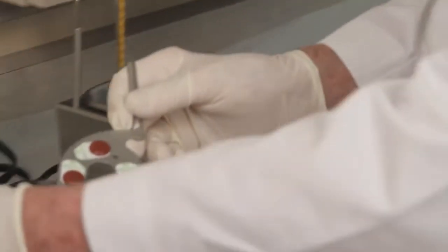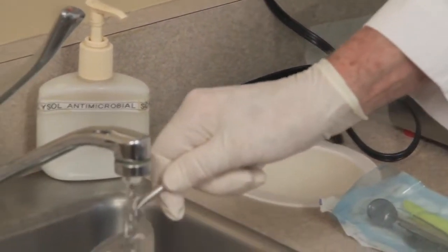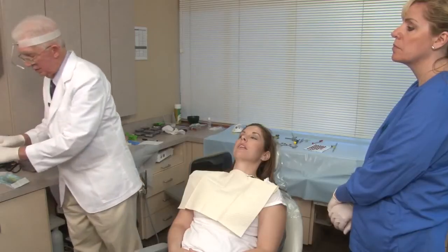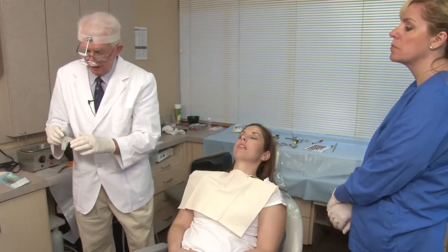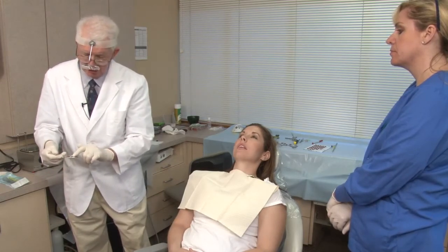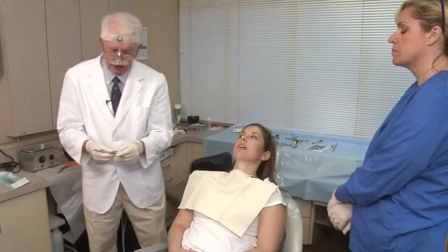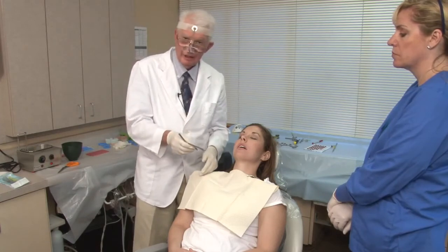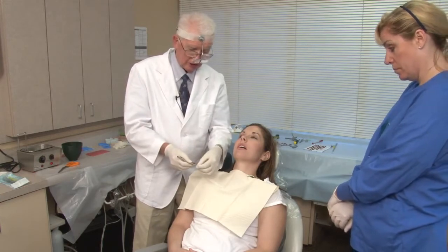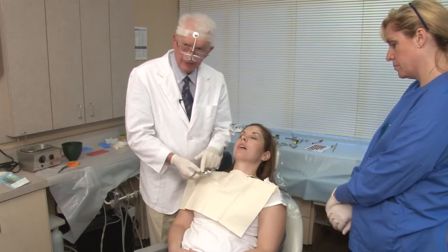So I will come over to the sink, turn on the cold water, and I will run cold water over the bite fork. That cools the bite fork, but at the same time, it also cools the base of the compound, so that the soft part of the compound is only on the surface. The base of the compound is rather firm. So that helps to prevent me from overseating the bite fork too far onto the teeth and having the teeth touch the metal. When you take your bite fork, teeth only touch the compound.